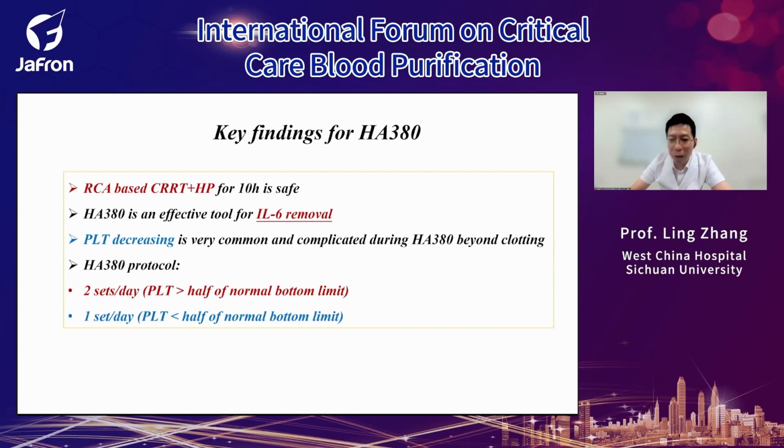If the patient's platelets are normal and there are no changes during the treatment, we can use 2 sets per day, maybe more than 20 hours per day. But if the platelets decrease, especially by more than 15%, or to half of the normal lower limit, we should use 1 set, maybe 10 hours per day, for this kind of absorbent in these patients.